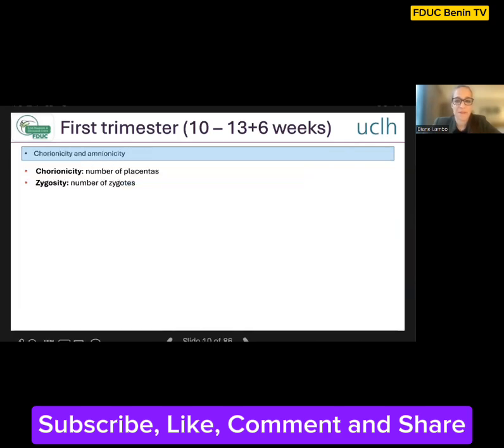So what about the number of fetuses present? And this is obviously when you're assessing a multiple pregnancy in order to determine the chorionicity and the zygosity. Now, briefly, chorionicity refers to your number of placentas, and zygosity refers to your number of zygotes. And it's essentially asking, are the twins identical?